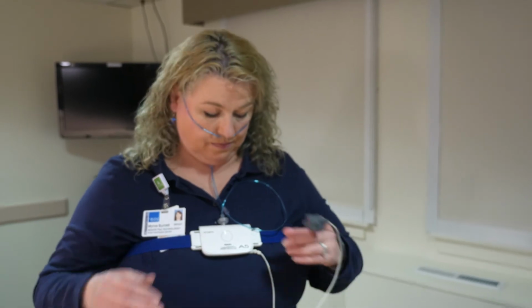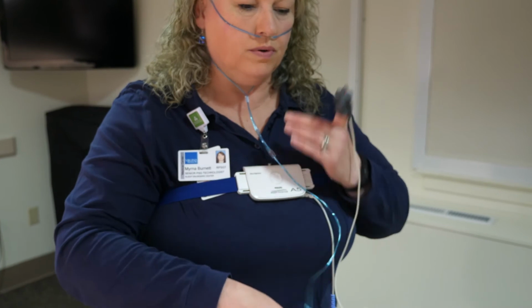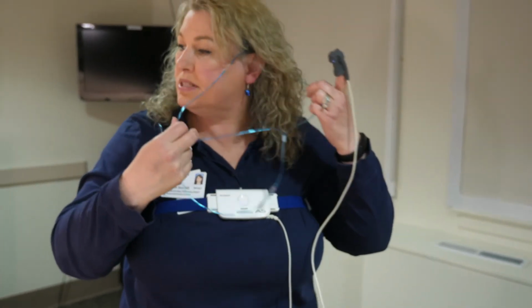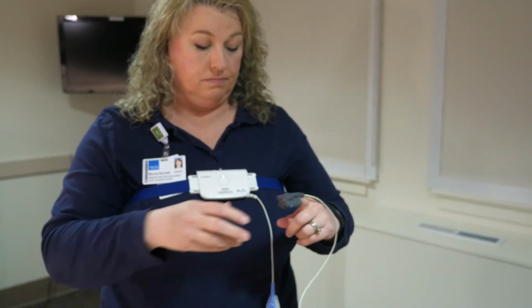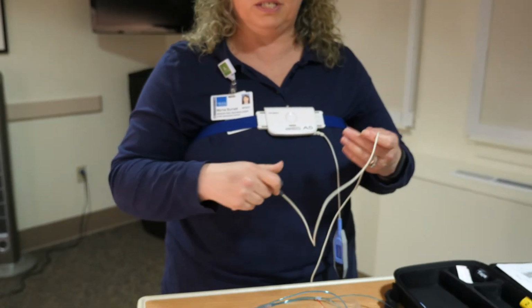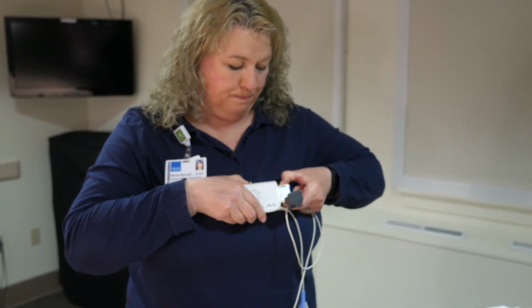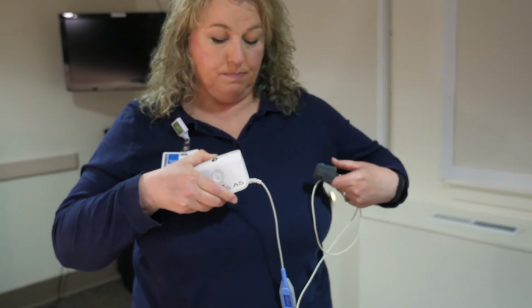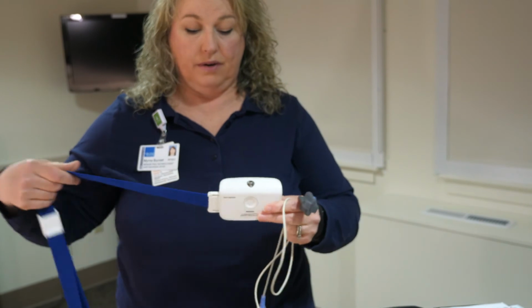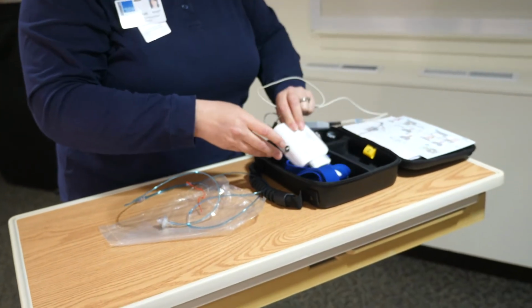Then in the morning, you'll get up and remove the equipment, take off the cannula. This will go in the garbage. They're one-time single-use patient only. So just untwist it, throw it in the garbage. You can remove the oxygen sensor from your finger. There's no need to coil it up and retwist tie it if you don't want to. And then for the belt, just simply pinch the clip together, take it out and remove it. Then you can just fold this all up and put it back into the kit.